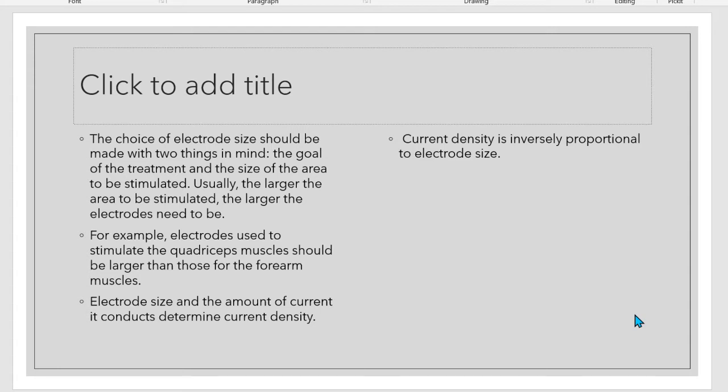So remember also that the electrode size and the amount of current density is inversely proportional. So when you say inversely proportional, that the smaller the electrode, the thicker the current density. Baga ang current density ana sabot kusog siya kay baga god, no. But the larger the electrode, the current density becomes thin and it is dispersed. No, dili siya focus.